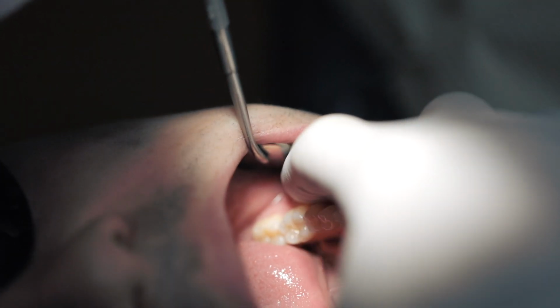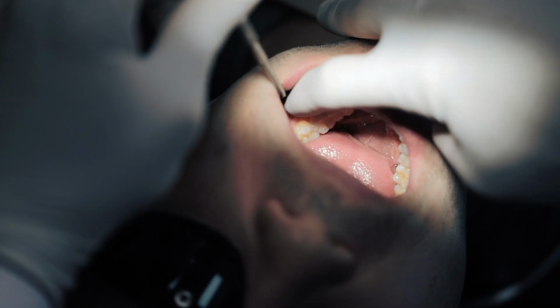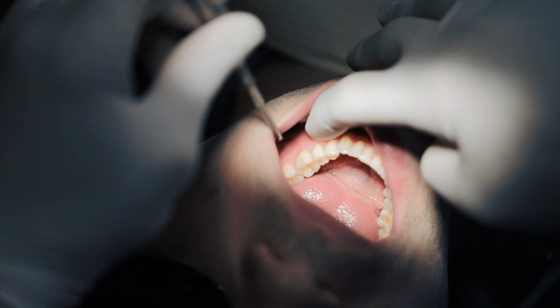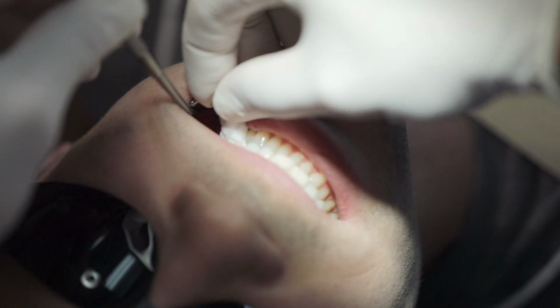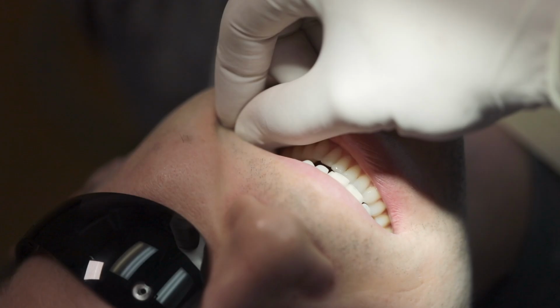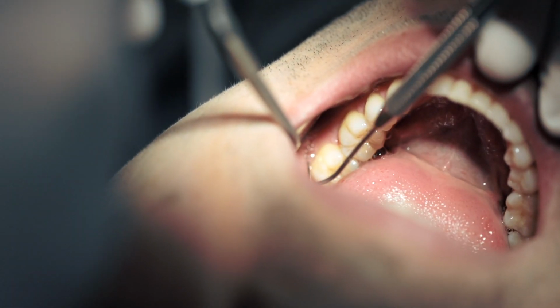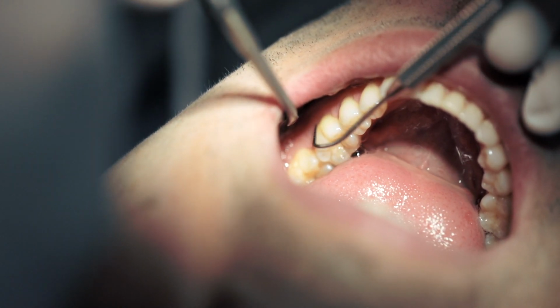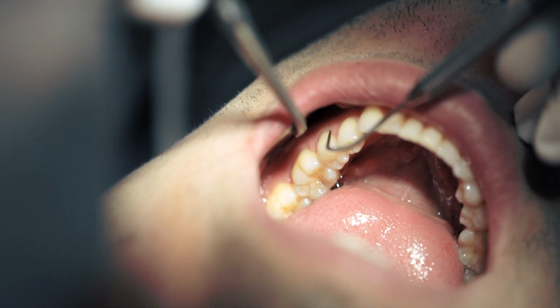Next, palpate the apical areas of the 3 teeth. Radiographic lesions or hyperresponses to either percussion or palpation are going to be the main things to look for when determining whether you're dealing with apical periodontitis. Then have them bite on a cotton roll. Again, start with the mesial, then distal, then the suspected problem tooth. Now perform perioprobing on all 3 of these teeth and look for any deep probings. Pain on chewing, especially on release, usually indicates a cracked tooth, and isolated probings may indicate a root fracture.